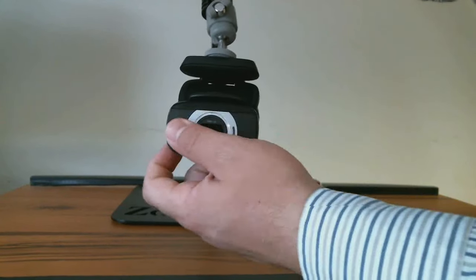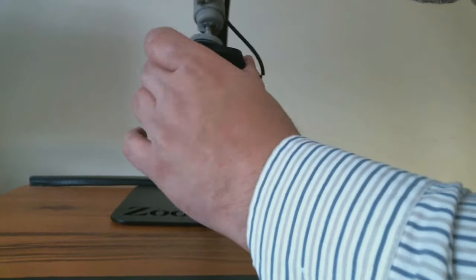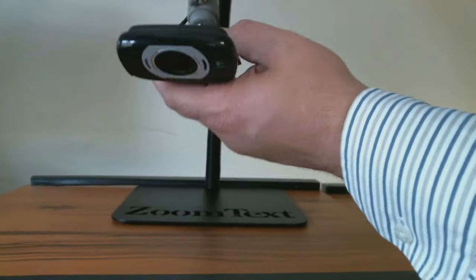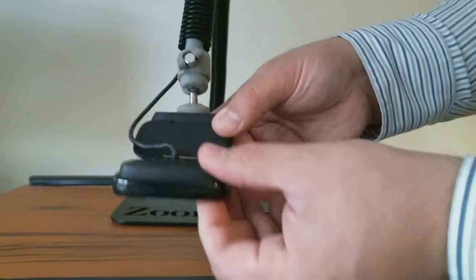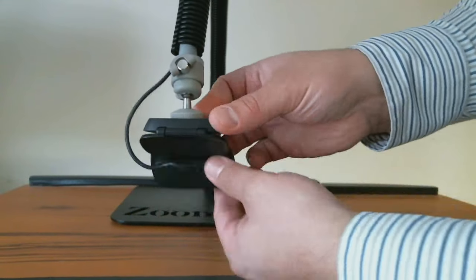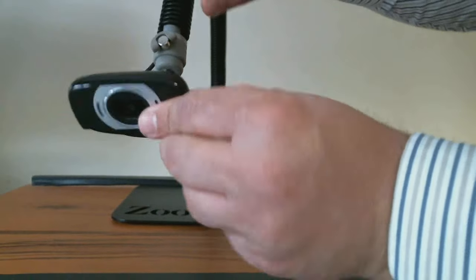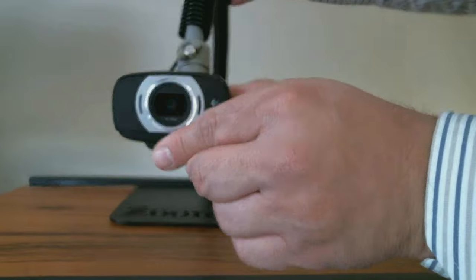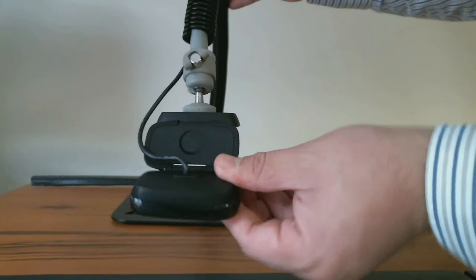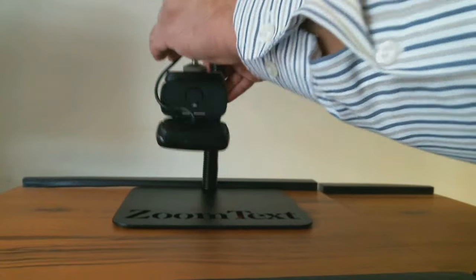This head swivels back and forth. I generally want to have this oriented kind of like this, okay? And hopefully you can see this. You want to have the eye of the camera pointing down, okay? So this whole thing kind of collapses. There's no right or wrong way to do this really, but I'm just going to show you how I do it. So you can see the eye of the camera here. I'm going to have it face down because we're going to have printed material underneath the camera.